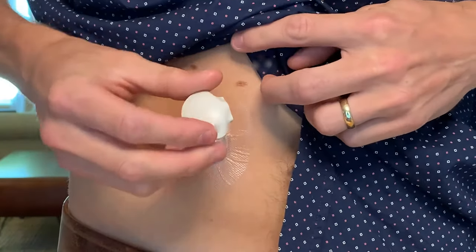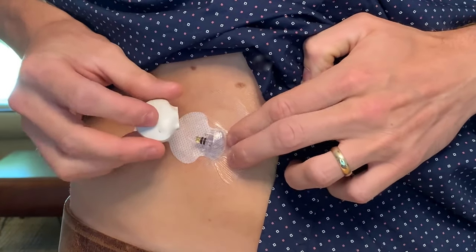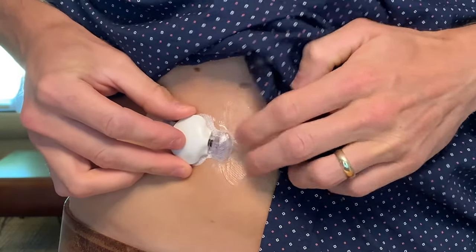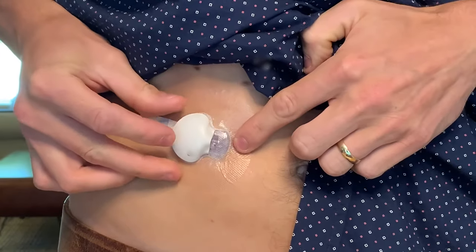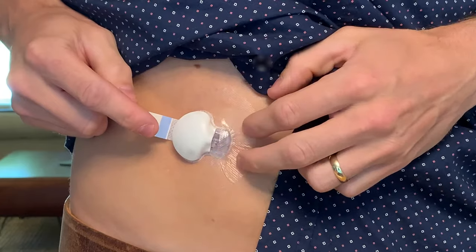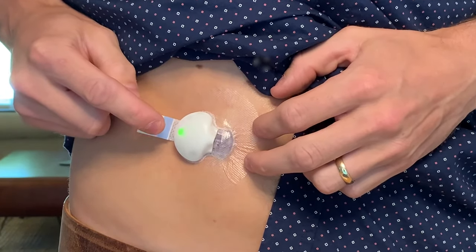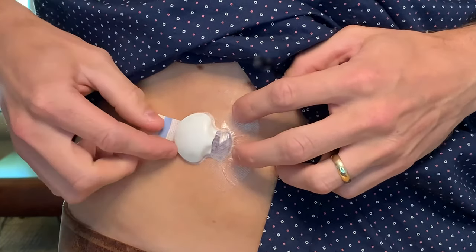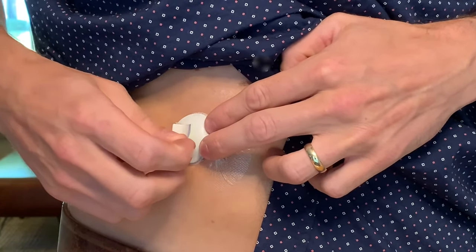Make sure to smooth everything down and apply gentle pressure to make sure everything adheres well. Now I can secure the sensor with one hand and slide the transmitter on until it clicks into place with the other. The green light starts flashing, which means it's connected. I'm going to gently fold the tab right over the transmitter like this to hold it in place.